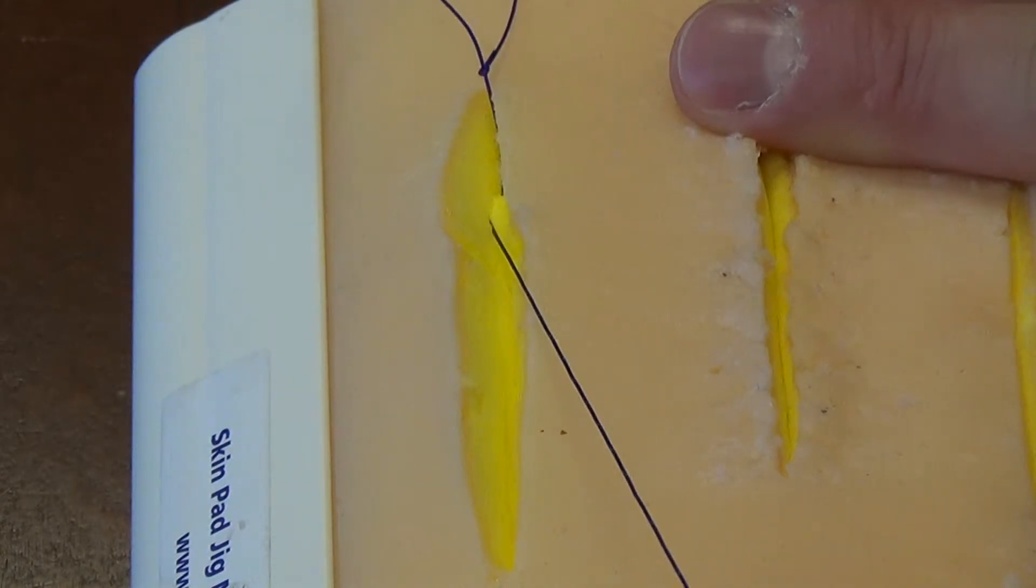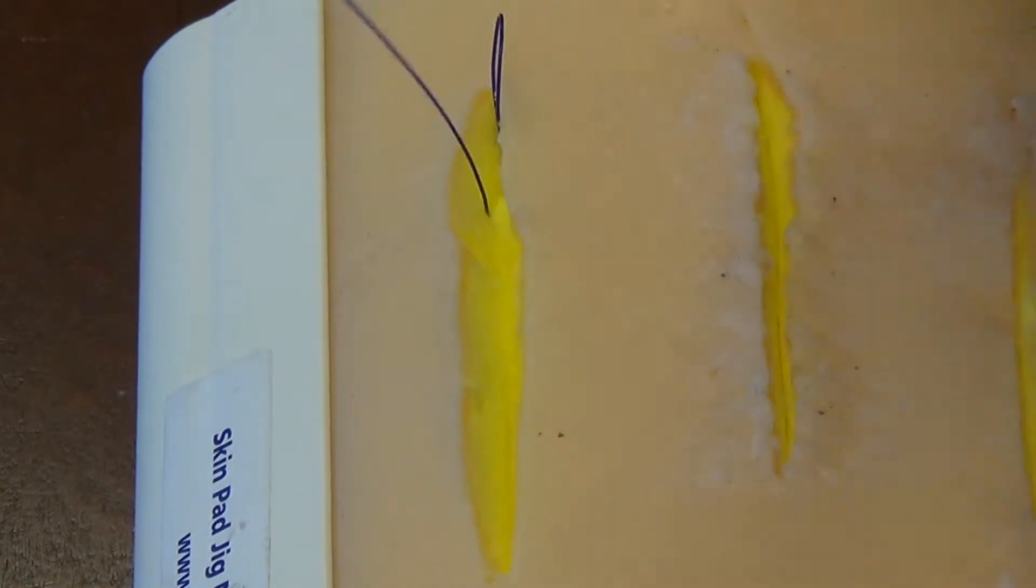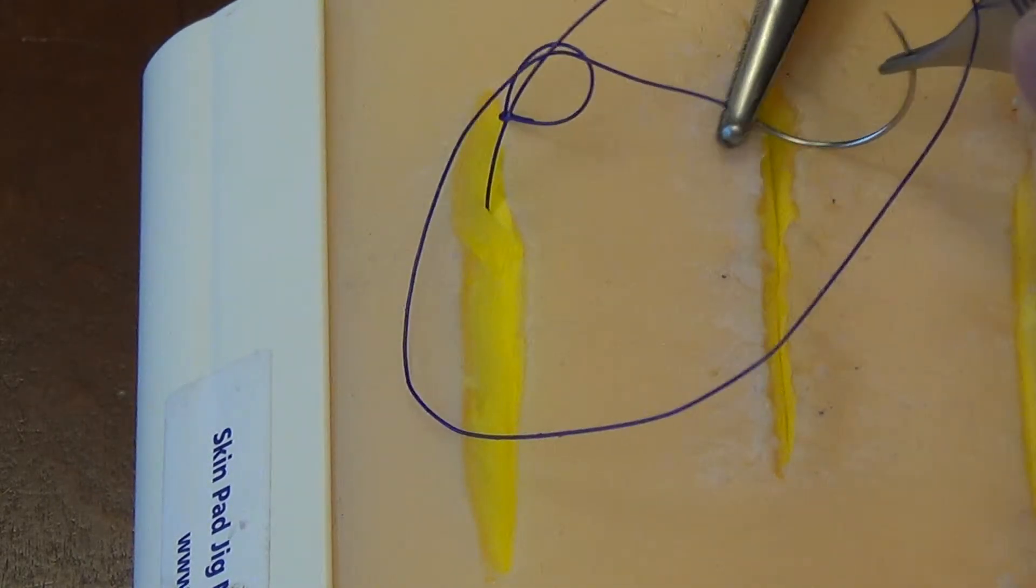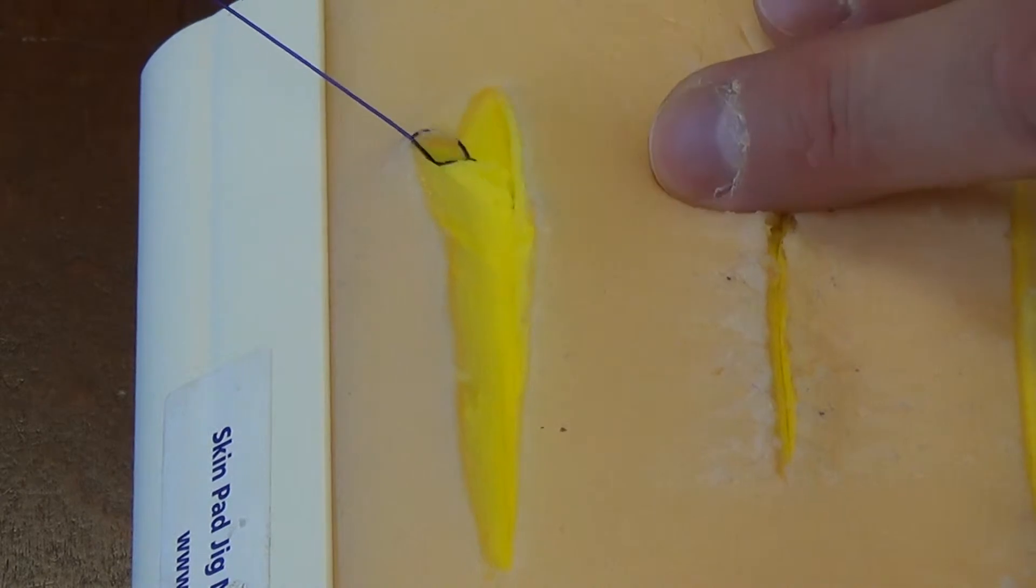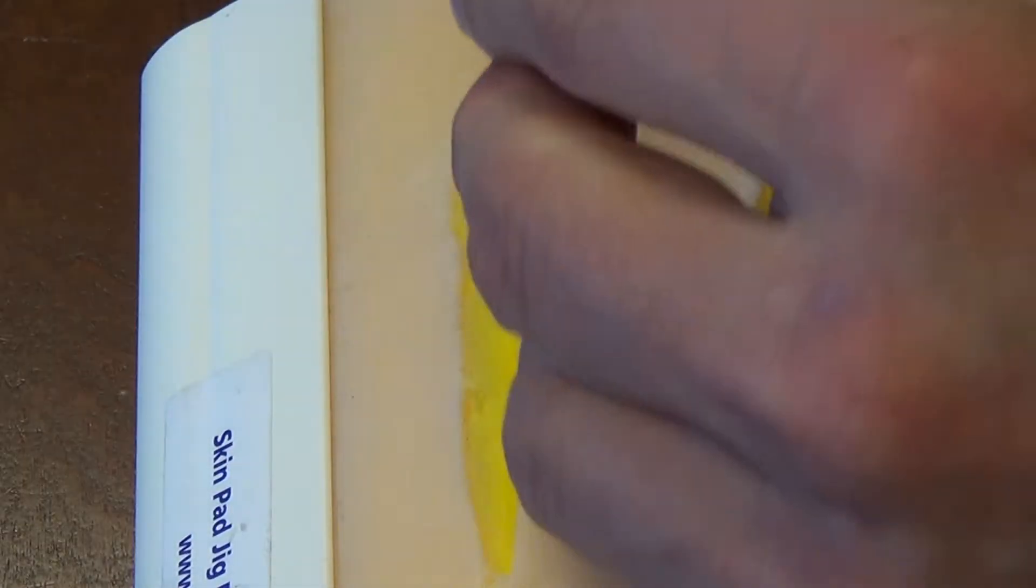As I pull the suture, you can see that that variable loop is getting smaller. Before it gets too small, I'll pass the needle through the loop and then tug on that and it creates the fixation.